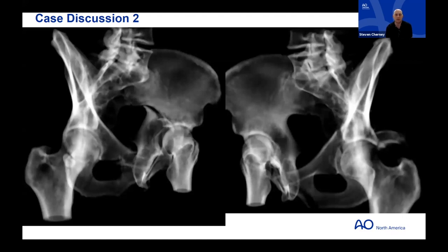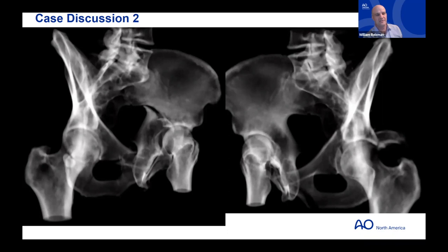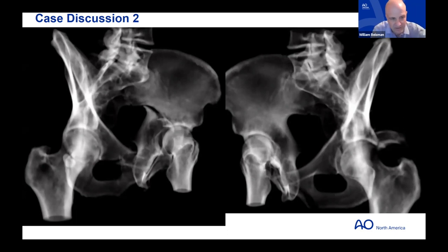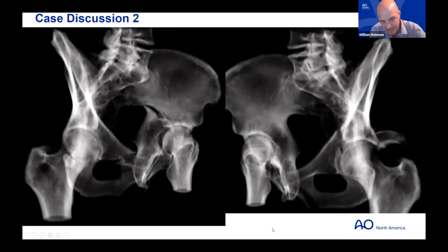Looking at the available oblique views for this case: the ilioischial line is disrupted, the iliopectineal line is disrupted, and there appears to be a gull sign indicating a posterior wall component. This looks like a transverse posterior wall. The ischial ramus isn't clearly visible on the obturator oblique in this instance.